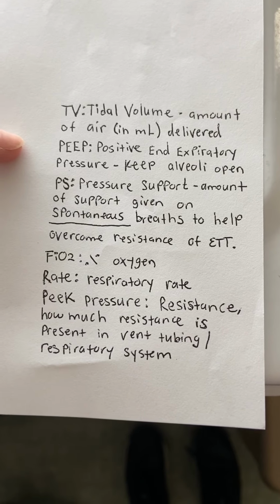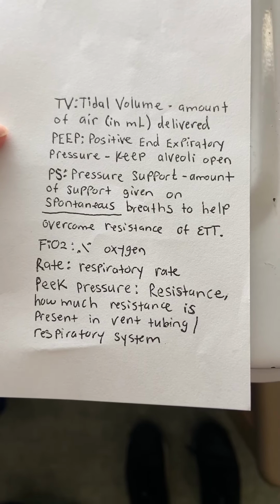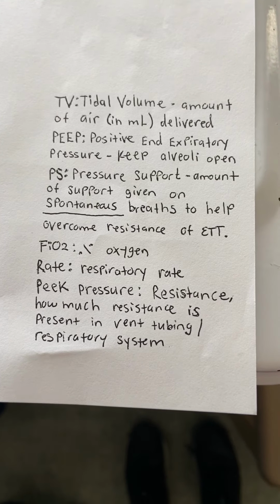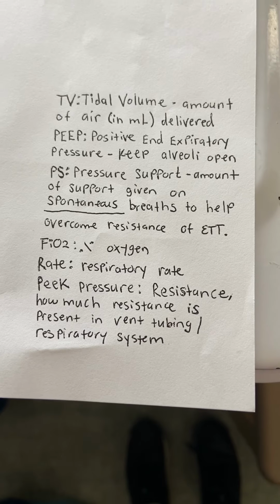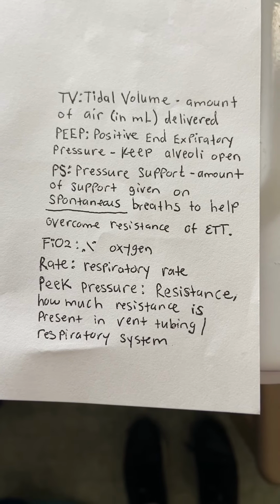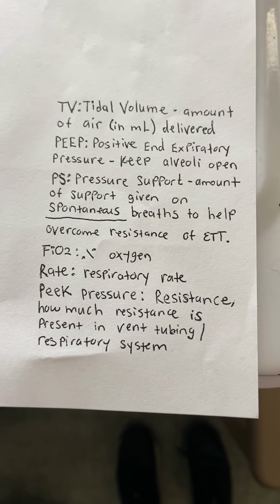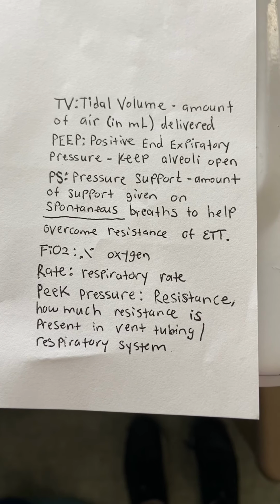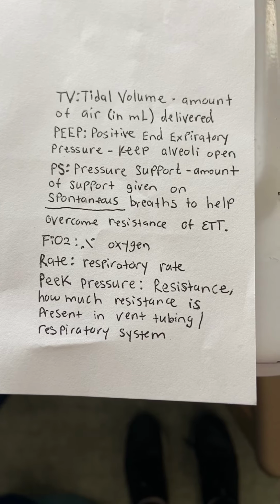PEEP is positive end expiratory pressure. This is just something that the patient receives pretty steadily throughout the ventilation process, and all it does is help keep the alveoli open. Alveolar collapse can be detrimental to patients who are intubated because that's where gas exchange occurs, in the alveoli, and we want to make sure that they stay open.